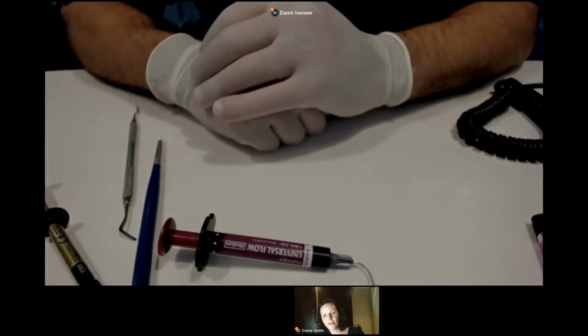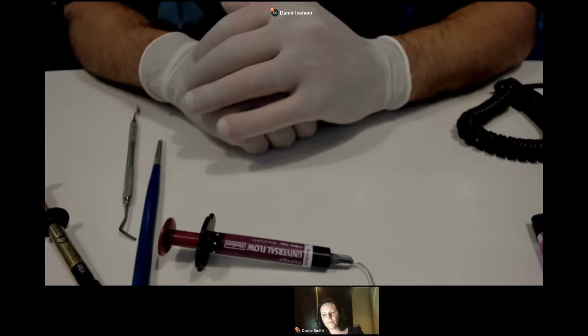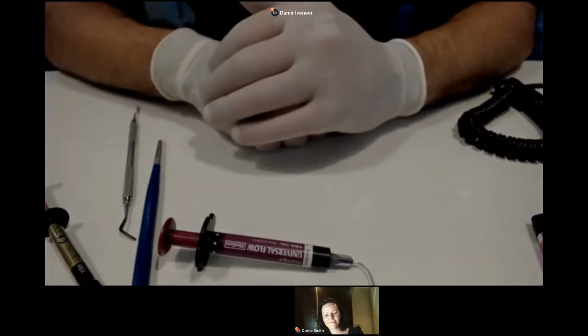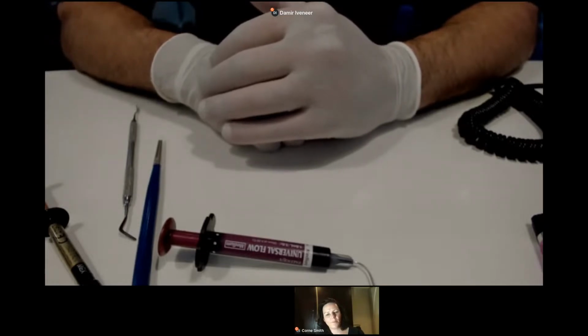And you, as a dentist who works with the microscope, I guess you can really see that after injecting into the matrix, when it goes all the way through the contacts in the right way, it will be already finished after you cure it.